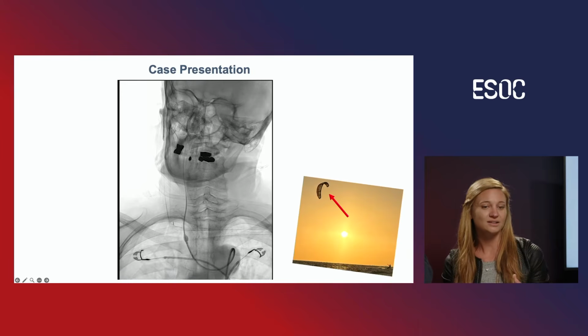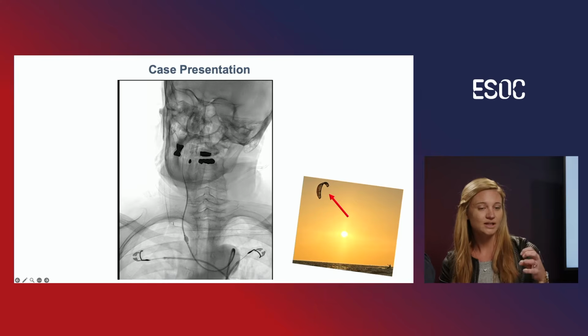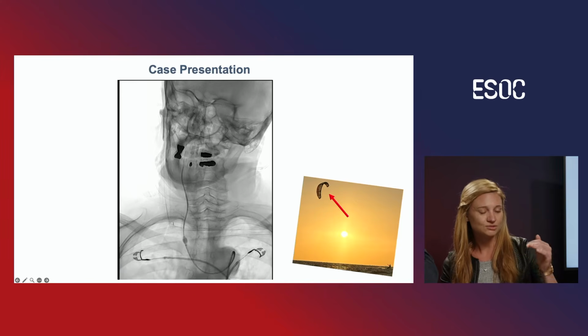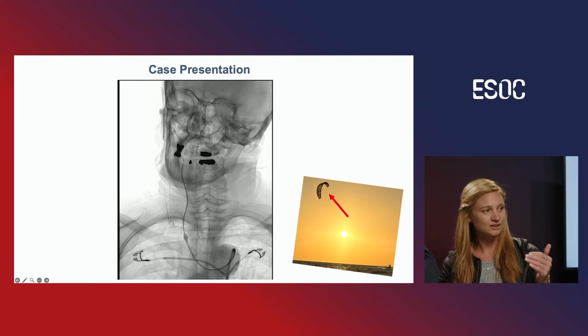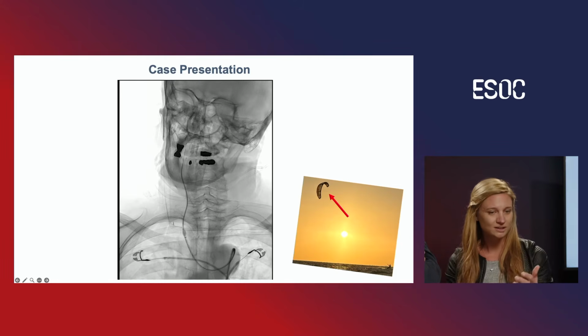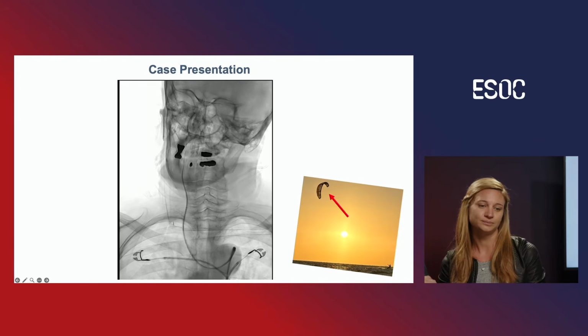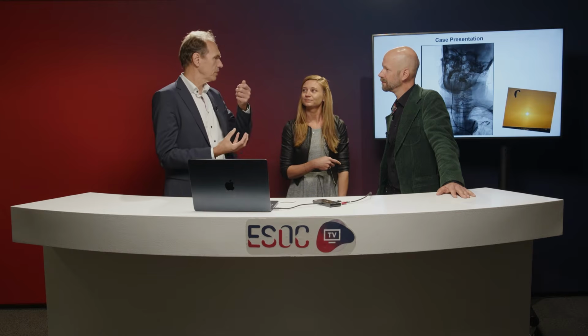It's like a kite that uses the wind to go up. Here you can use a balloon to go up with the bloodstream and generate the stability to get the diagnostic catheter further up. Then you deflate the balloon again and follow the diagnostic catheter. So in this case, do you inflate the balloon to let it go with the flow, or did you also inflate it to have a stronger anchor to bring up the diagnostic catheter?